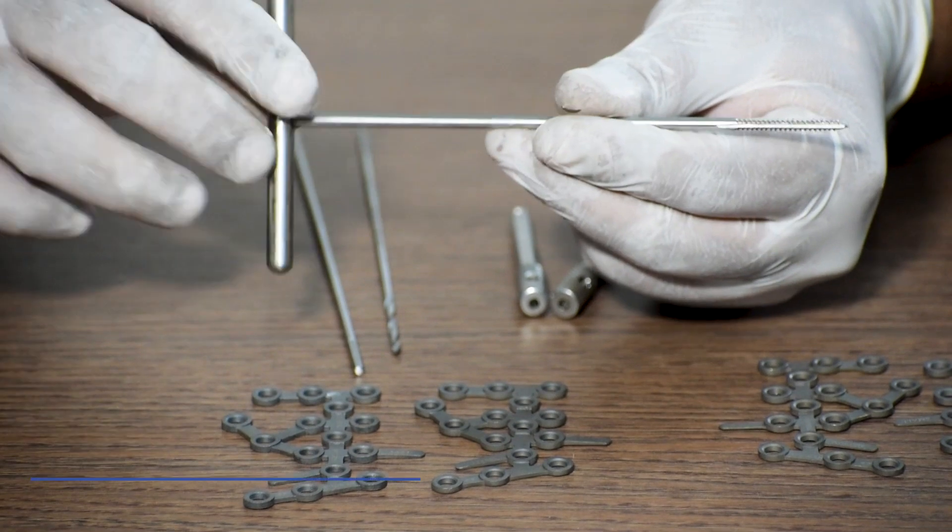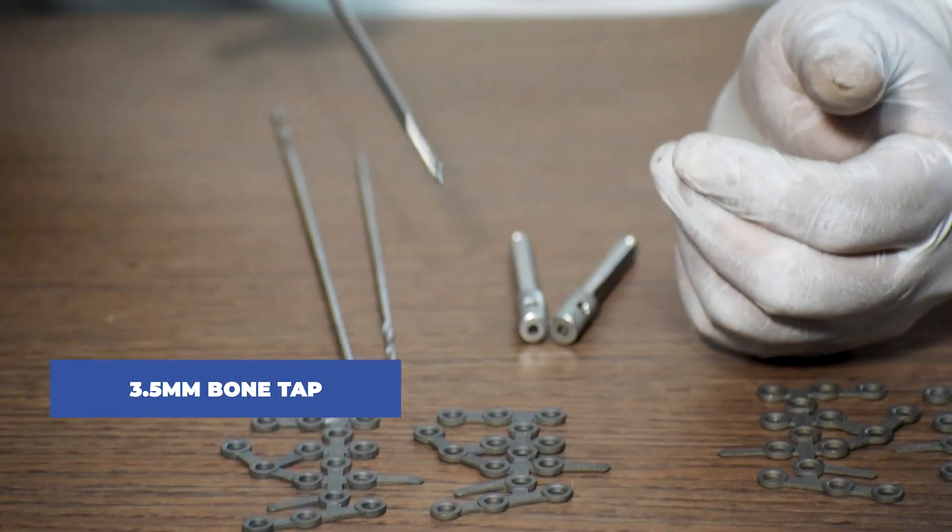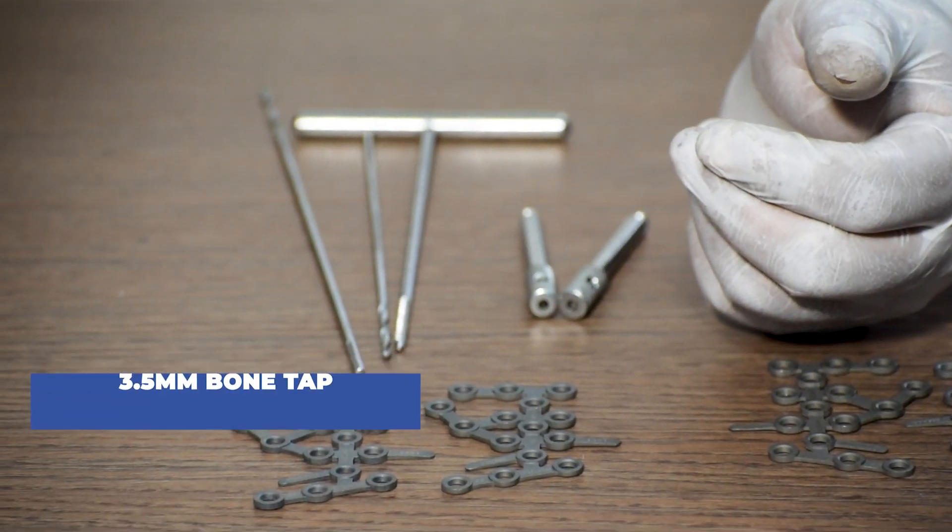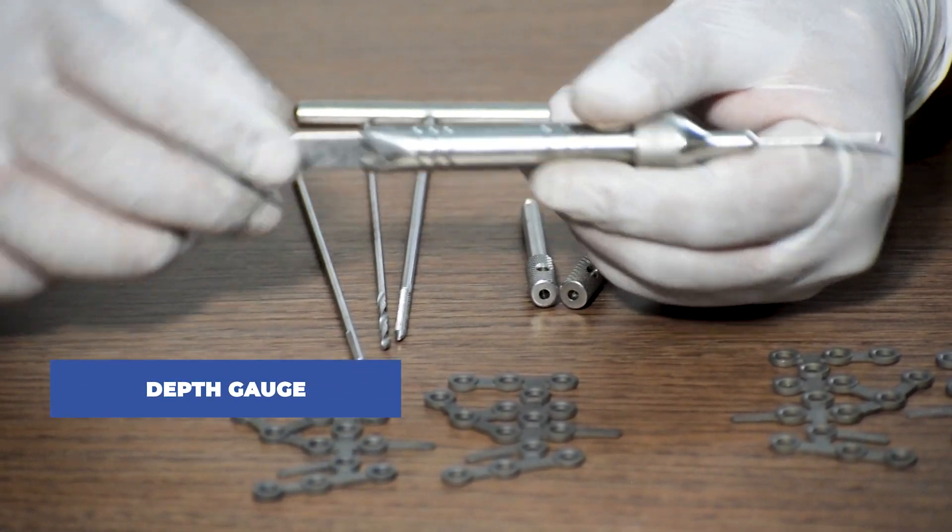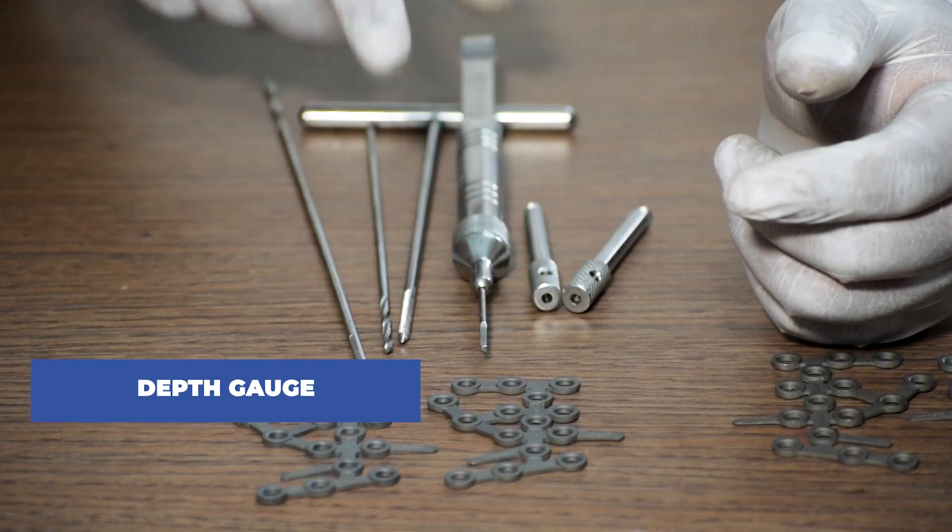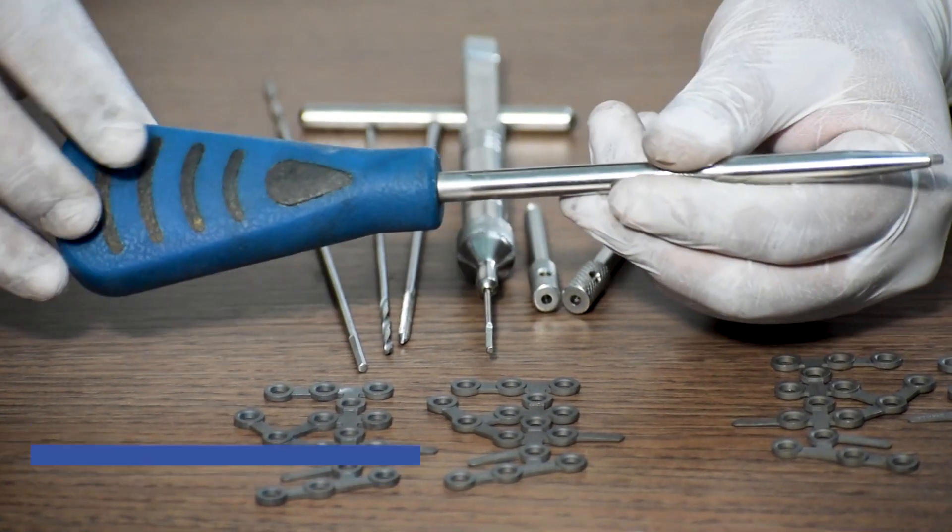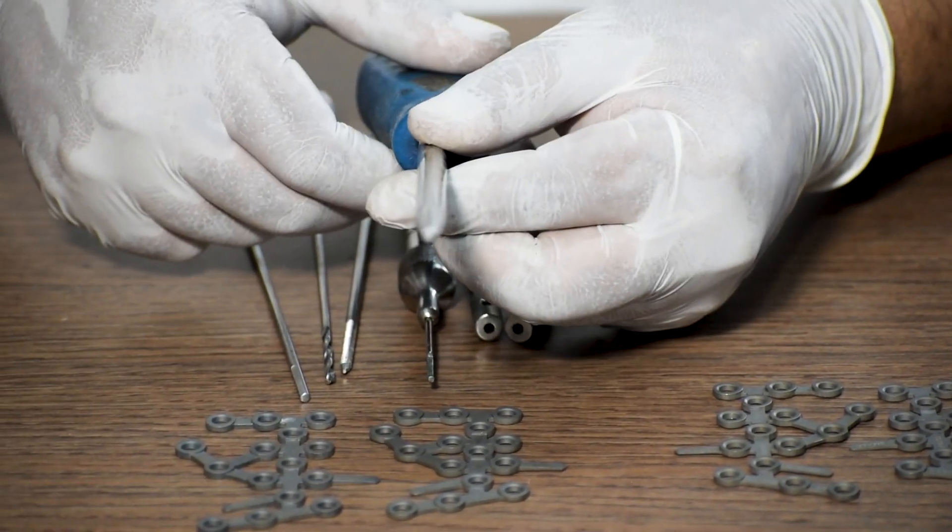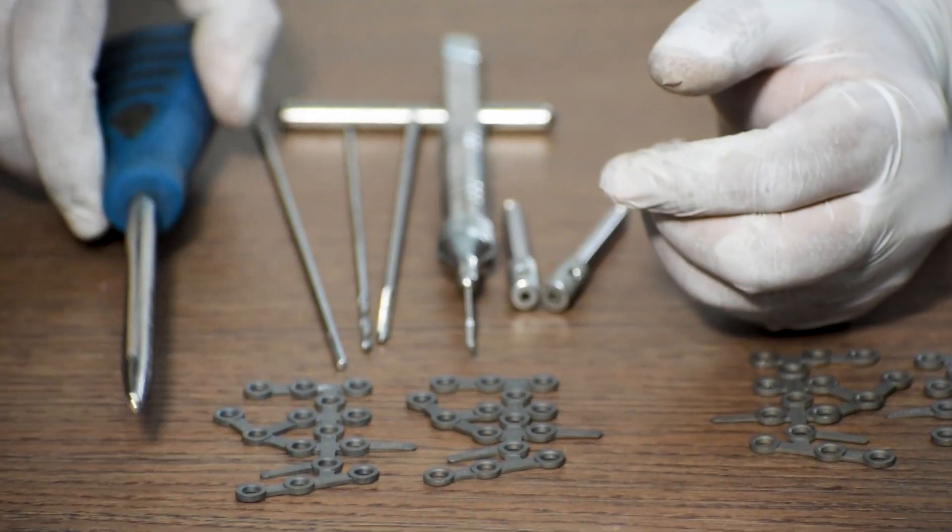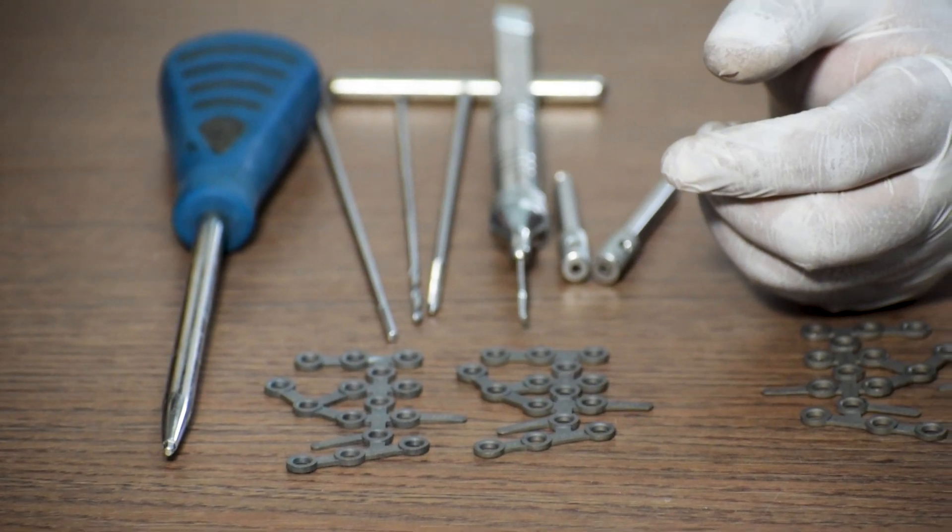Next, 3.5 mm tap for non-locking screws. Then depth gauge in order to measure the length of the screw required. Then 3.5 mm solid screwdriver will be needed.